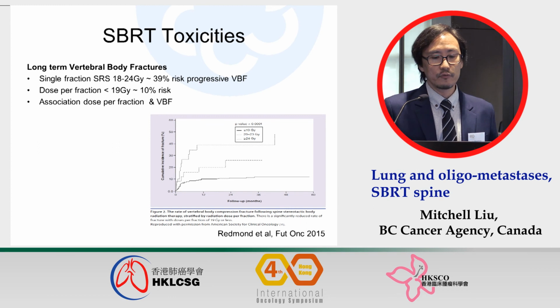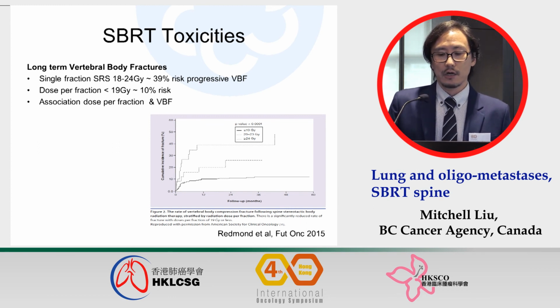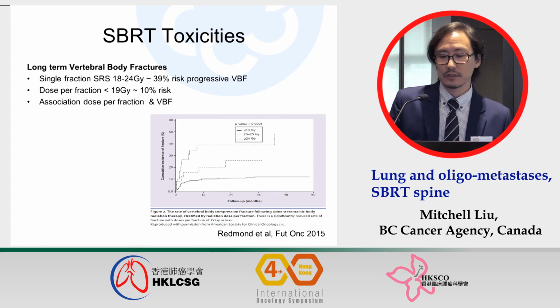Another commonly reported toxicity is vertebral body fracture. It more commonly happens if you use a single dose regimen like 24 grays in one fraction, and in that case you may have more than 30% chance of vertebral body fracture. However, if you do a fractionated regimen or keep the dose per fraction lower than 19 grays, the risk should be relatively low, in the range of 10%.